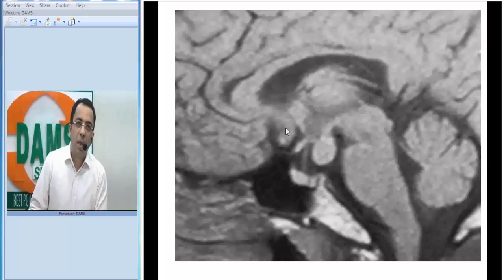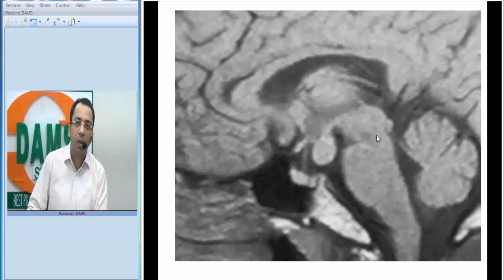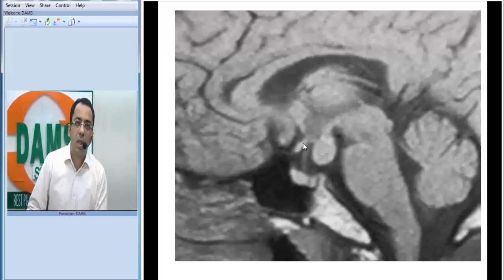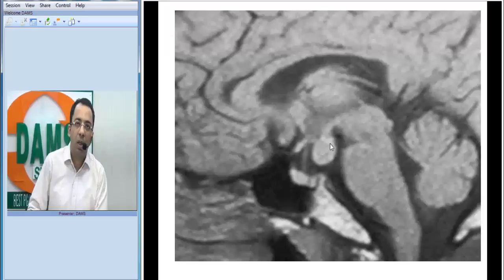Let us go anatomically. I am marking the boundaries of the third ventricle for you. This is the area of the corpus callosum. You can see the midbrain here. This is the cerebellar vermis. This is the area of the optic chiasma. This is the infundibulum. You can see the pituitary, sphenoid sinus, and clivus — and you can see a problem here.